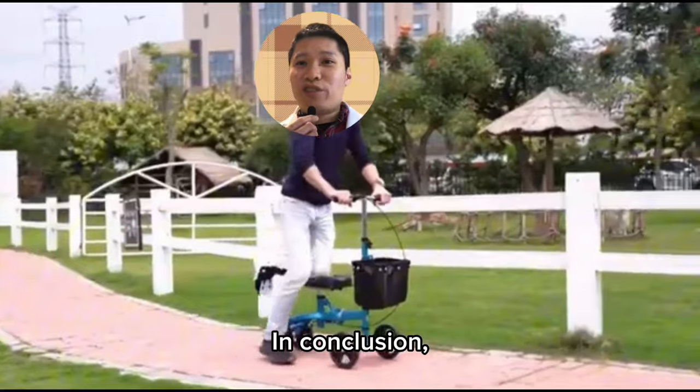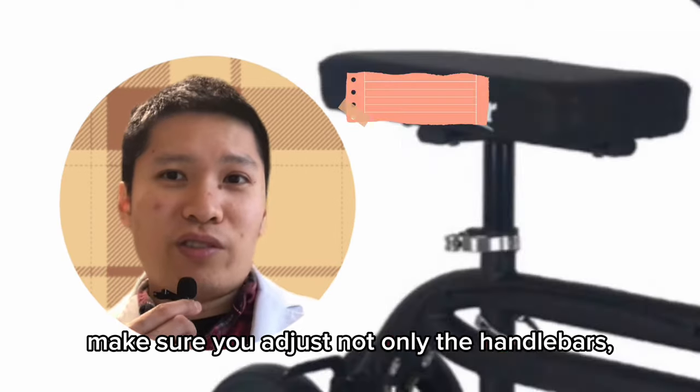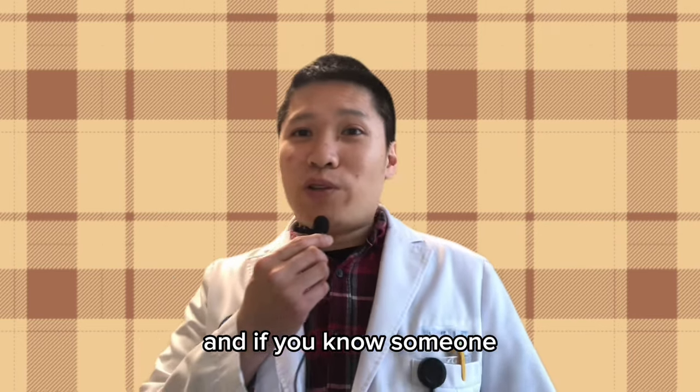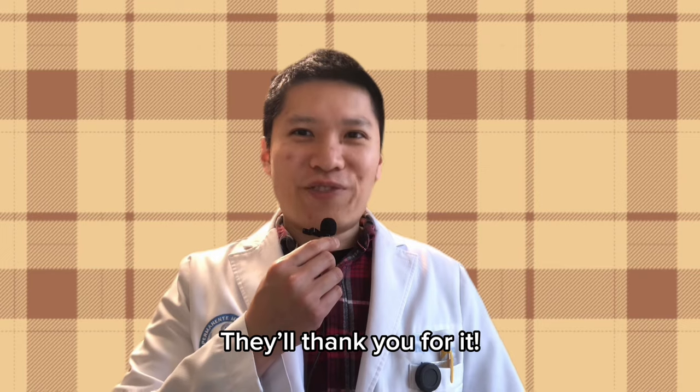In conclusion, if you are using a knee scooter, make sure you adjust not only the handlebars but also the seat to the proper height according to your size. And if you know someone who's using a knee scooter, share this video with them — they will thank you for it.